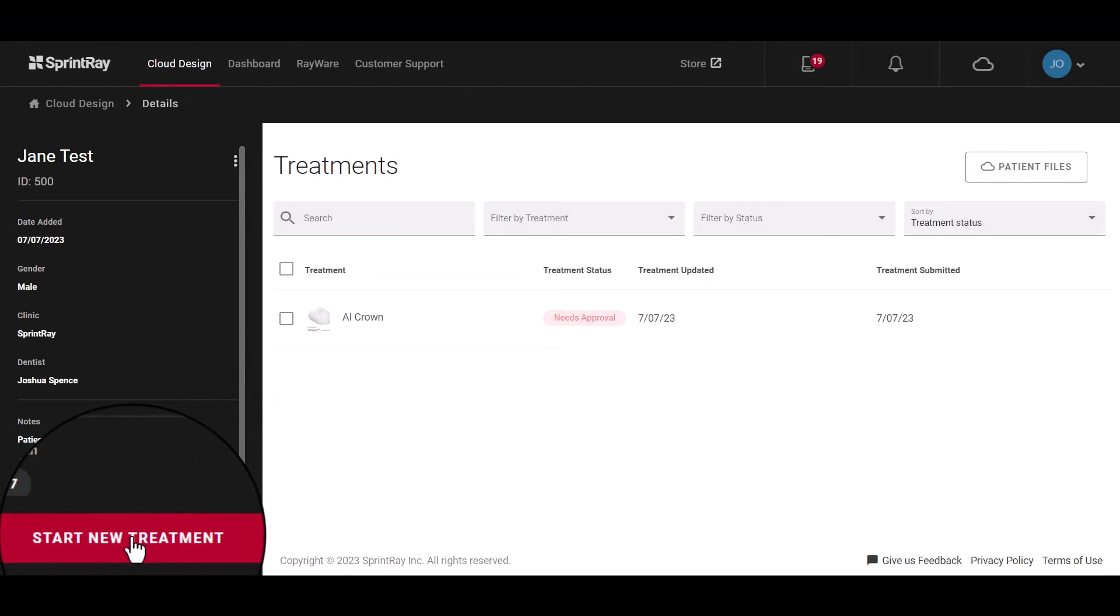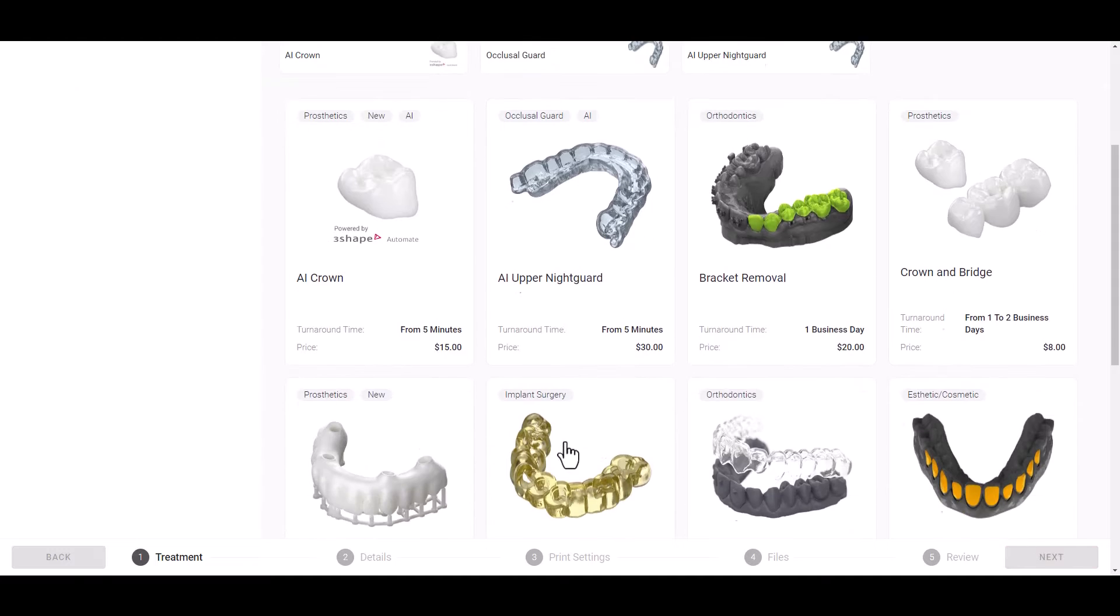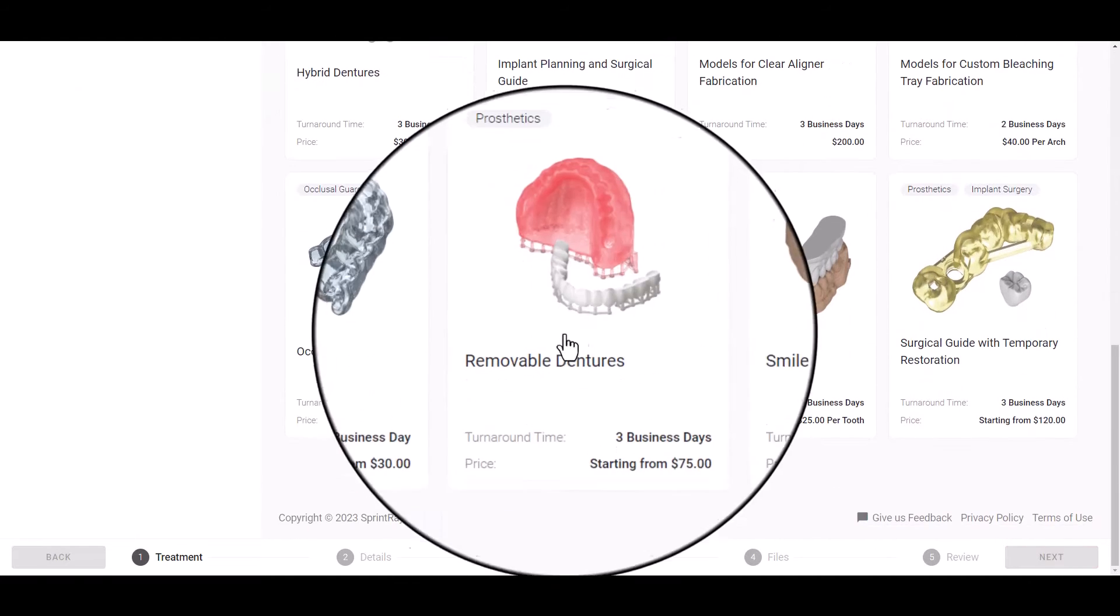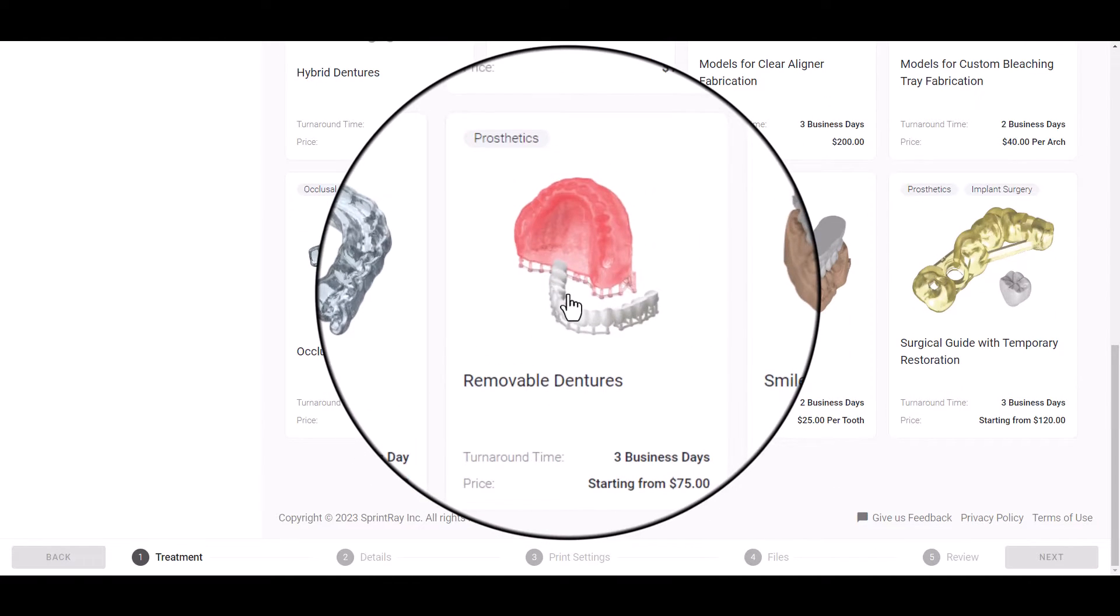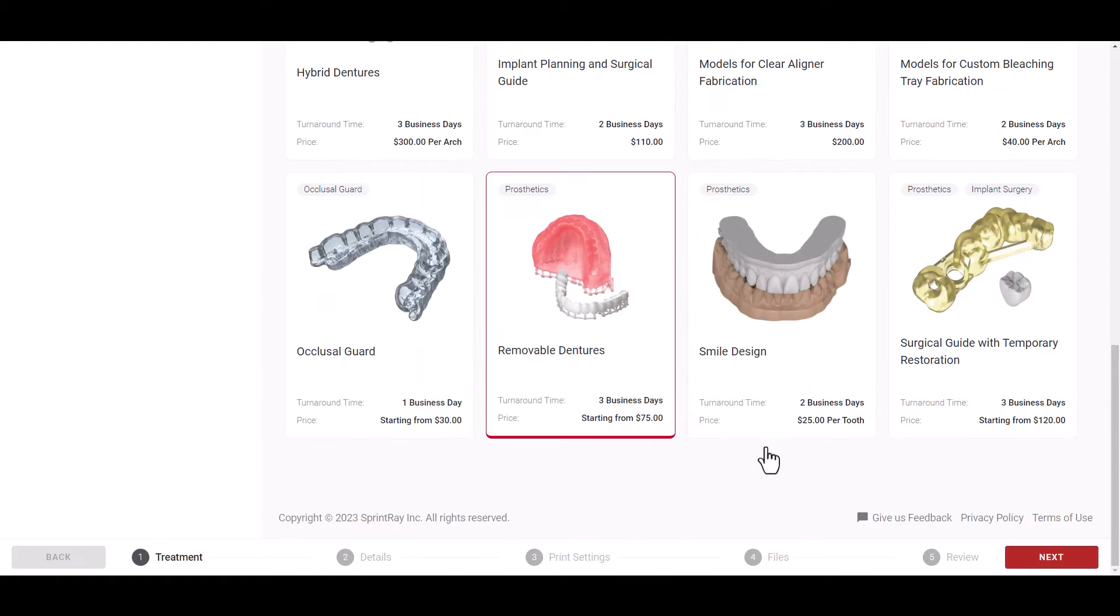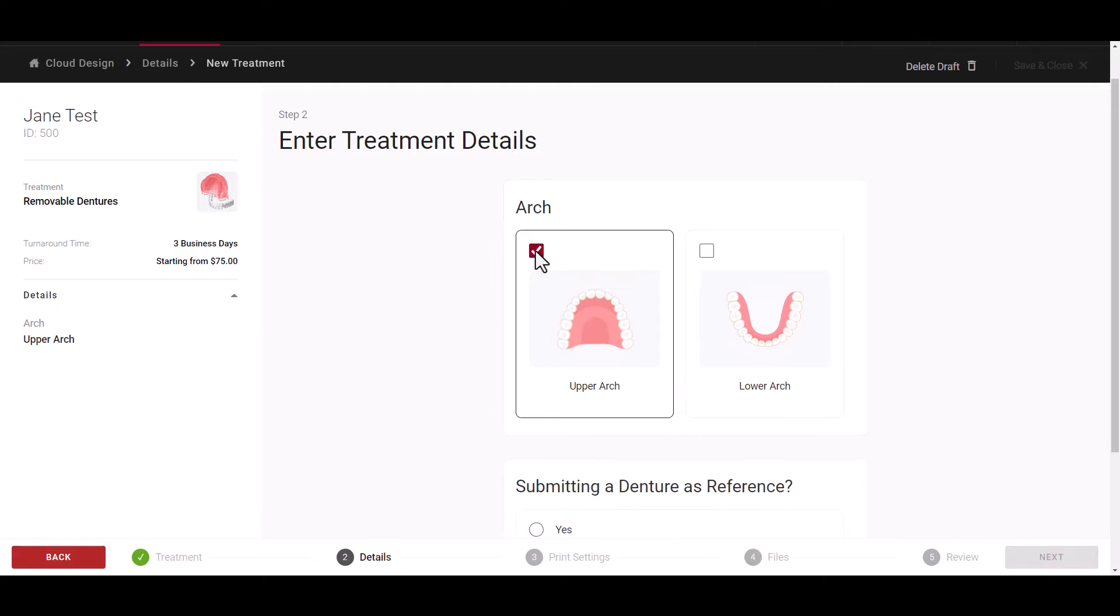To begin, select a patient and click Start New Treatment, then select the removable dentures option. Next, select the arch required for the design and specify the type of denture.